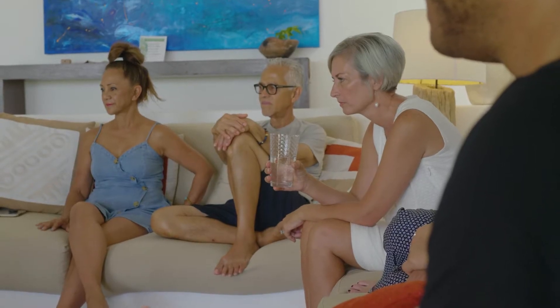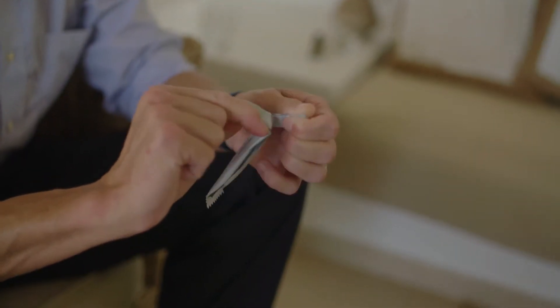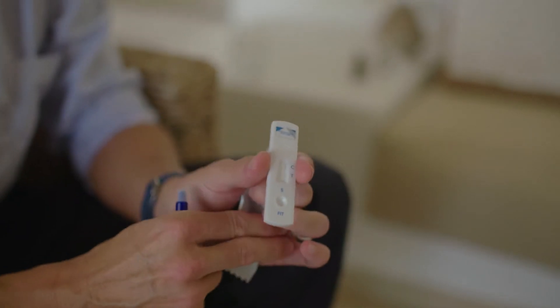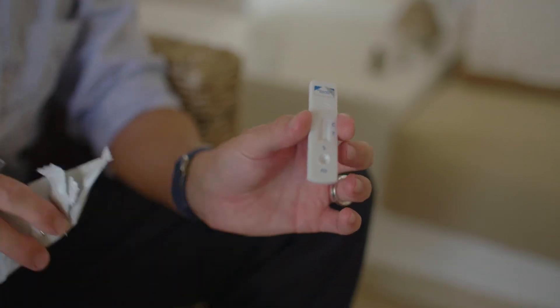It's the second-generation FIT test. It really consists of two pieces: a tube and a cassette. The cassette is very similar to the pregnancy test — that's exactly what this is. The only difference is the analyte: what we're looking for is a different biomarker.